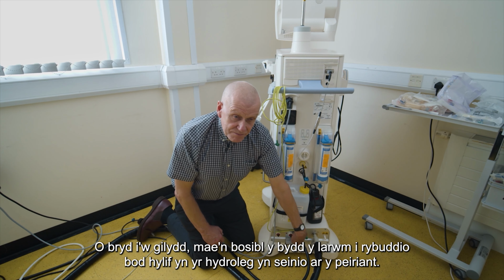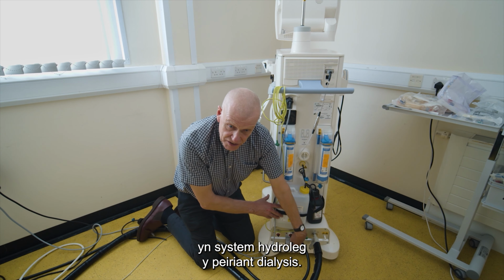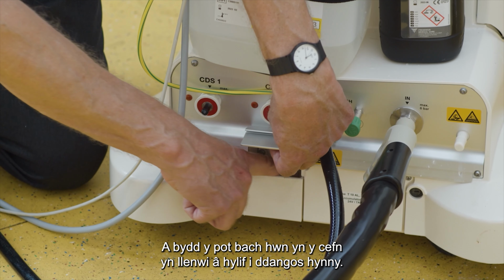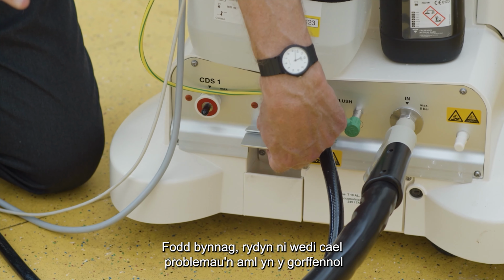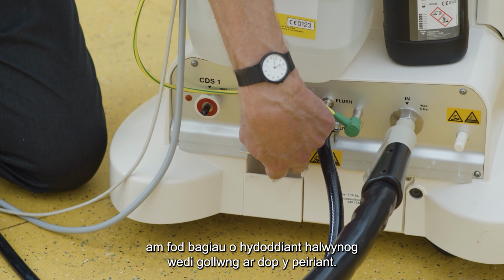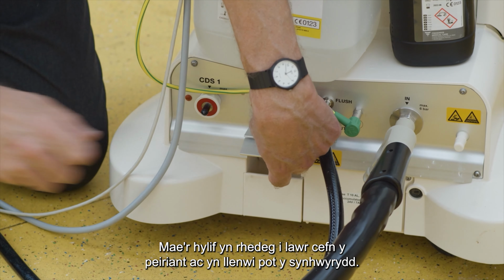You may get a fluid in hydraulics alarm on the machine sometimes. That could indicate that there is a leak within the hydraulic section of the dialysis machine. And that is shown by this little pot on the back here filling up with fluid. There's a leak sensor in there that will give the alarm. However, often we have had problems in the past with bags of saline that have leaked at the top of the machine. The fluid runs down the back of the machine and fills up this sensor pot here.